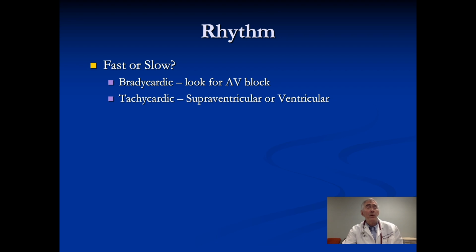Rhythm is very important. Rhythm basically says, is it regular or is it irregular? But that's just an adjective. Is it fast or is it slow? Again, another adjective. But you will hear terms like sinus bradycardia, sinus tachycardia. You may hear heart block. You may hear atrial fibrillation. All of these are rhythm terms of diagnoses. The regular and the bradycardic and tachycardic are just adjectives.